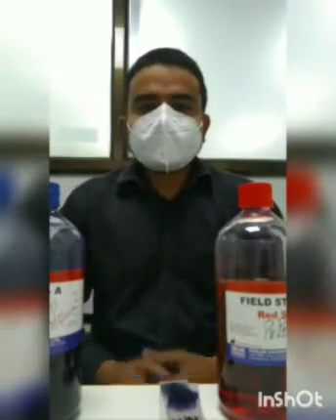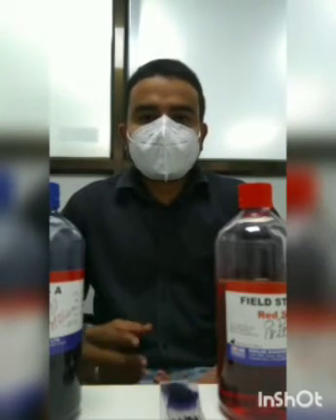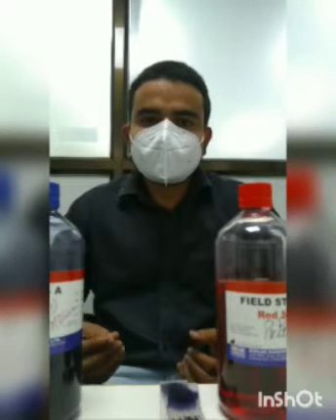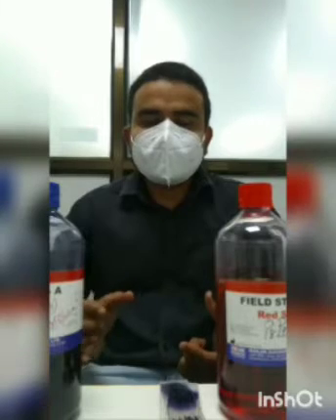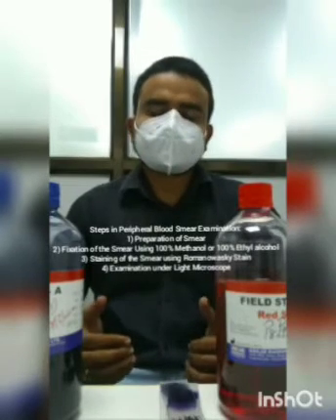So you all know about peripheral blood film. Basically, a peripheral blood film is the smear which is made from the venous blood. We make this smear on a clean glass slide, and then fix it and then stain it to see the various components of the blood under the microscope.